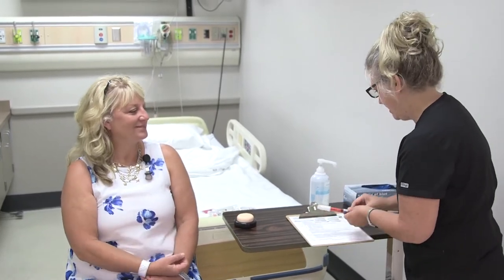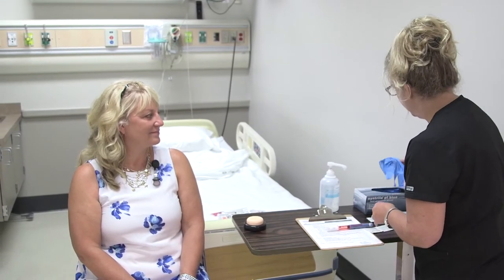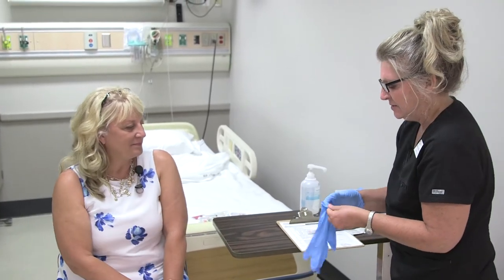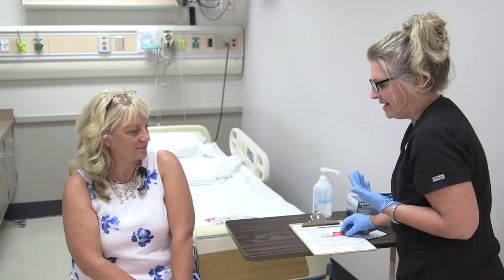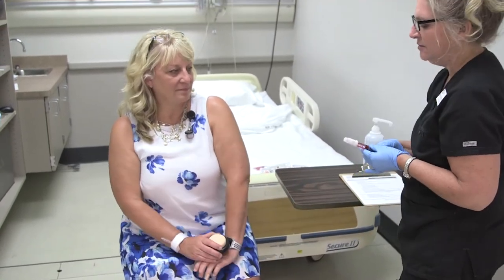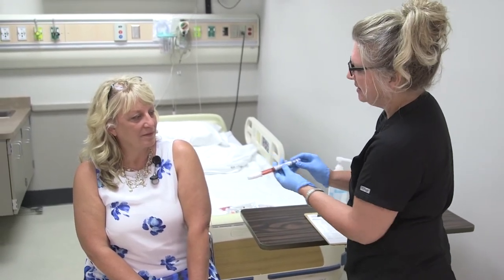How are you feeling? Good. Your blood sugars looked really good today — they stayed below 200 and above 70, so that's great. You've had this injection before, so you know what to expect. For injection sites, we can choose the outer arm, the abdomen, or the anterior thigh. The upper buttocks area is also an option but isn't used very often.